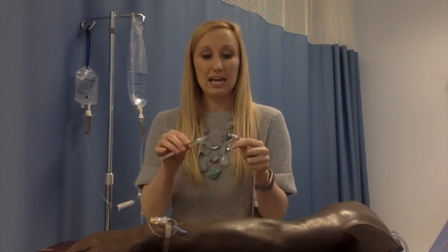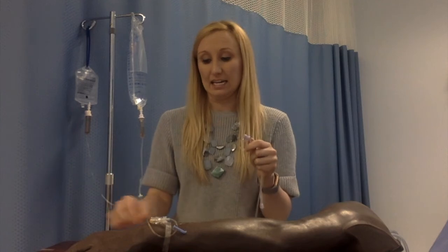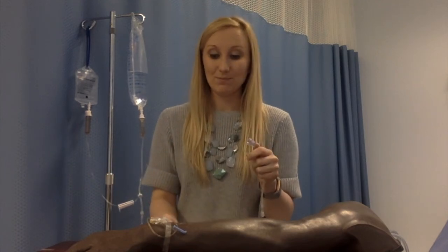If you want to use an IV push medication through an IV site where you have primary tubing, you would just connect the primary tubing up to the patient and use the port that's closest to the patient and clean off the site and insert the medication through this port. So that is your IV push medications.